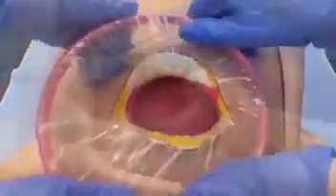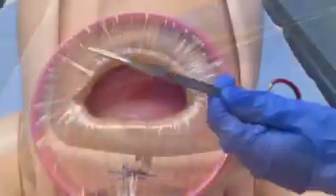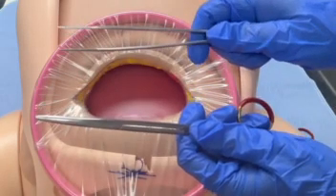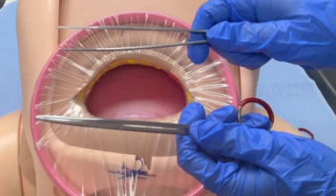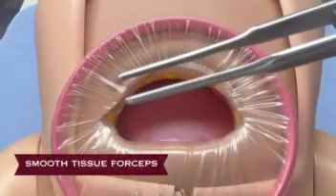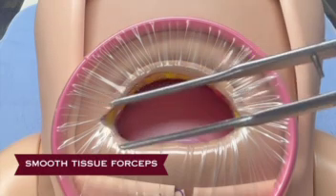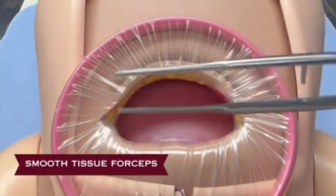After the peritoneal incision is extended bluntly, a single-use self-retaining retractor, like the one shown here, can be placed, or the bladder blade and Richardson retractor can be placed to ensure visualization. At this time, some surgeons will create a bladder flap. Given the delicacy of the vesicouterine peritoneum, Metzenbaum scissors and smooth tissue forceps are used. Smooth tissue forceps, as the name implies, are non-toothed forceps that grasp tissue atraumatically through fine serrations on the tips.